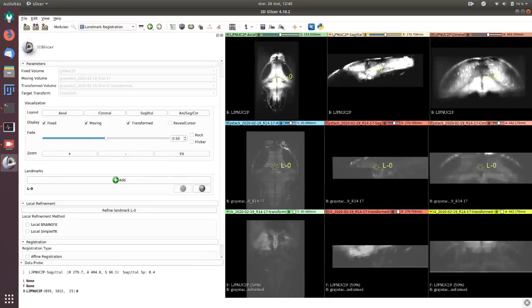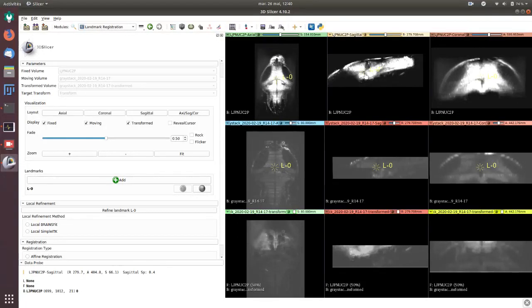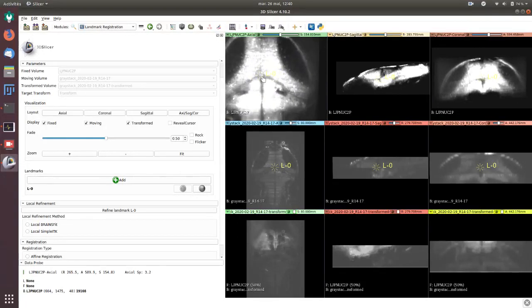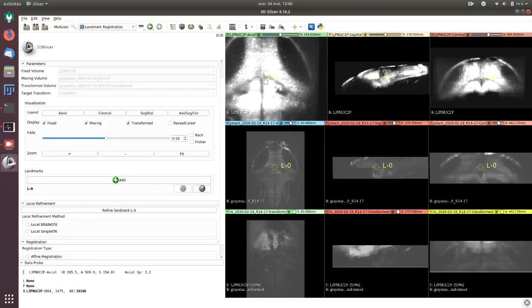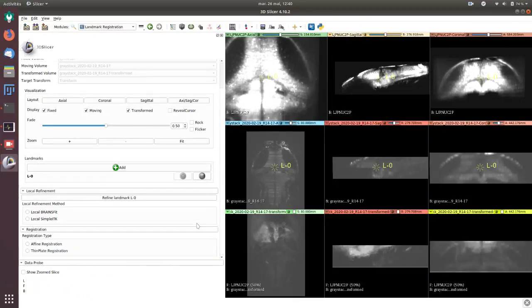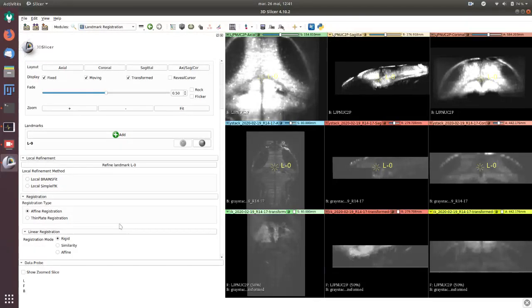Now you can see here a mix view. It does nothing because we didn't choose the registration type, so we are going to do a simple affine registration with a rigid and we can change this later.